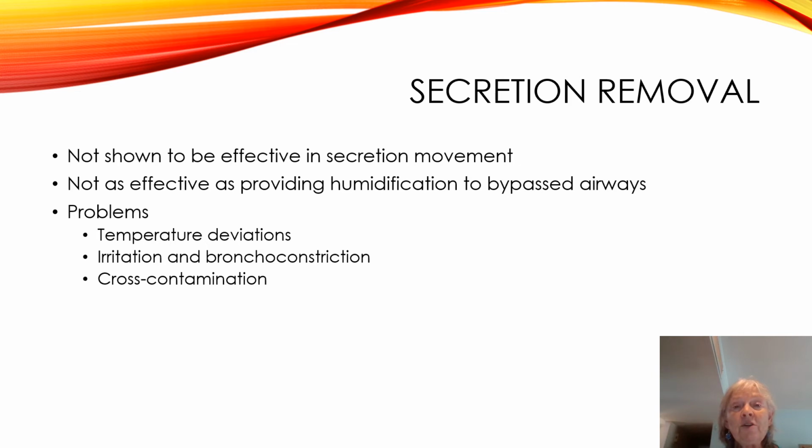What do we do then? We just basically try to raise the temperature in the room if that's what we need to do. Cross-contamination is another one. If you take your large volume nebulizer off and change devices, or the humidifier off, change devices and things like that, don't leave that sitting in the room and 2 days later, 3 days later, pick it up. You have contamination at this point, so you do have to be careful with that.